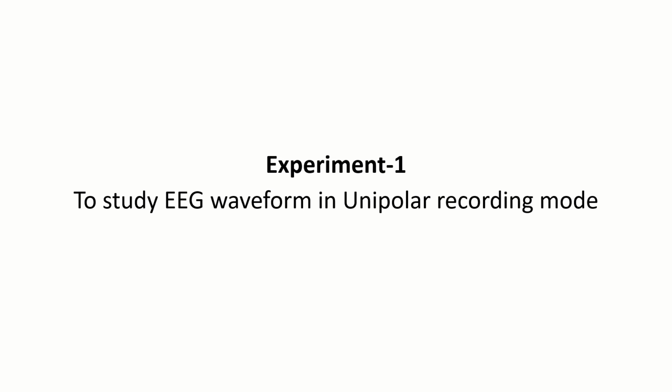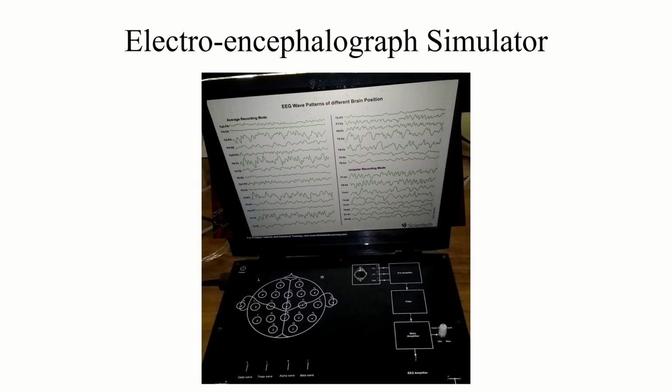This is experiment number 1. The object of this experiment is to study EEG waveform in unipolar recording mode. This is the electroencephalograph simulator which will be employed in order to perform the experiment.